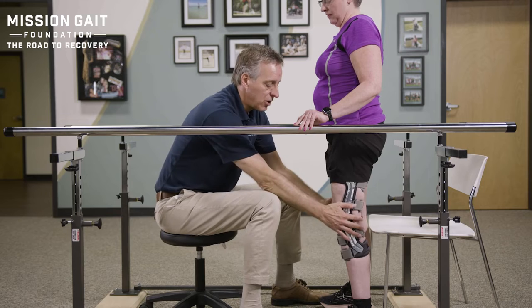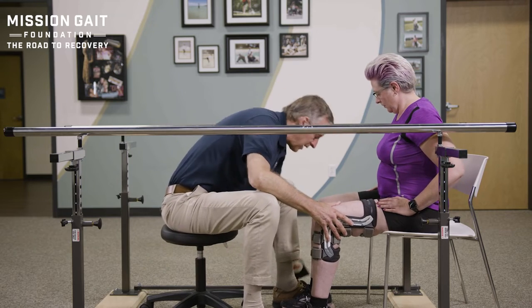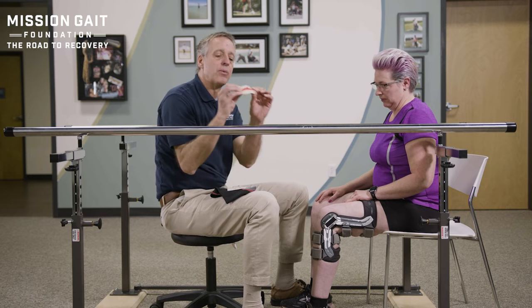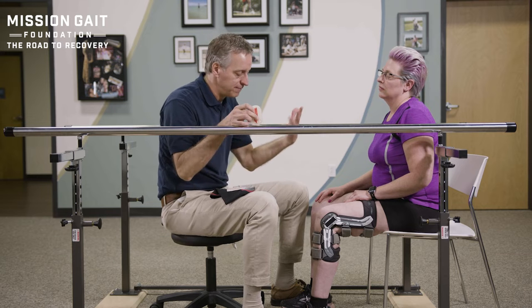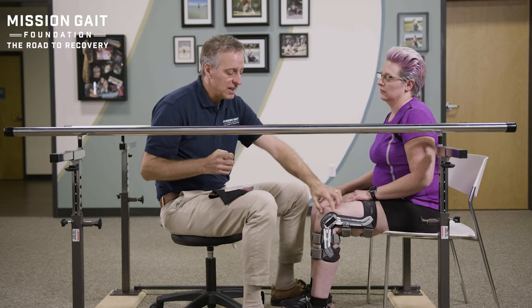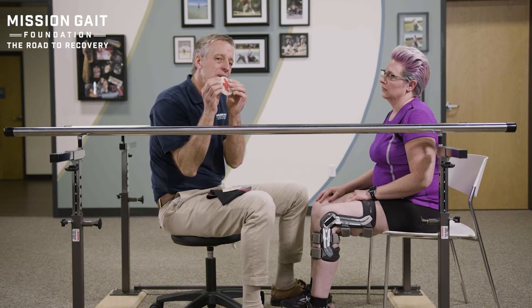If anything is bothering them, let's look at what that is and why, and how we adjust it. Now I want to look at two other things that come with these devices. This particular brace has knee supports — cushions on the inside of each side of the knee. The original ones are rubber suction cups, which work very well for a 45-minute to hour-and-a-half sports event. But in Sarah's case she needs the brace all the time for much longer periods, and these can really tear up the skin. So there are sleeves that give much more cushion without as much grip.